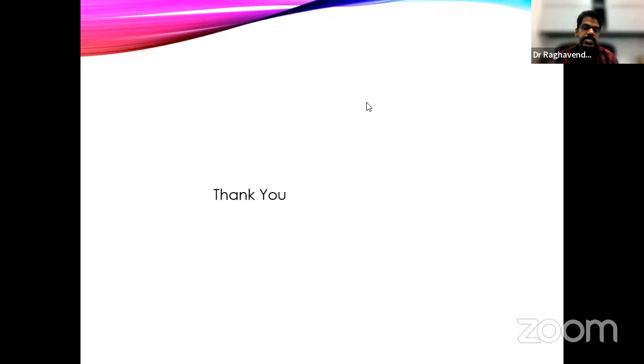I worked with it in my initial SRS work. There the problem I faced was from the vacuum system. At the age of 40 or 50, I don't think any human is available without any dental caries. When you put that dental material and suck and create a vacuum, it really hurts the patient. It really pains the patient. So that is one of the issues I am facing.